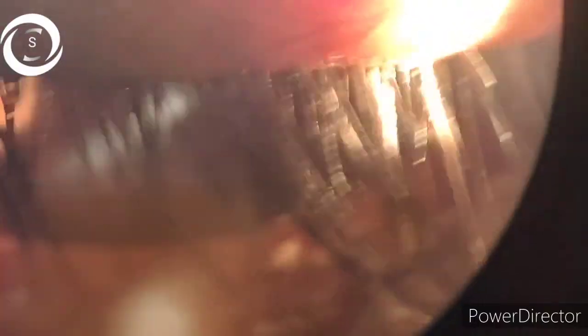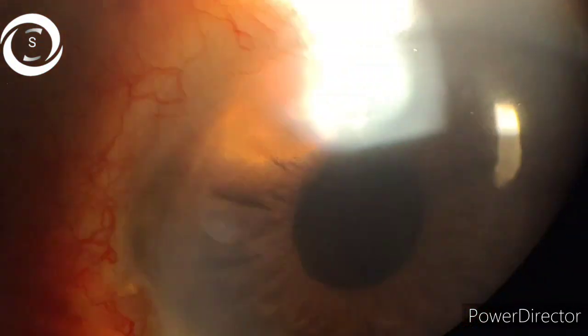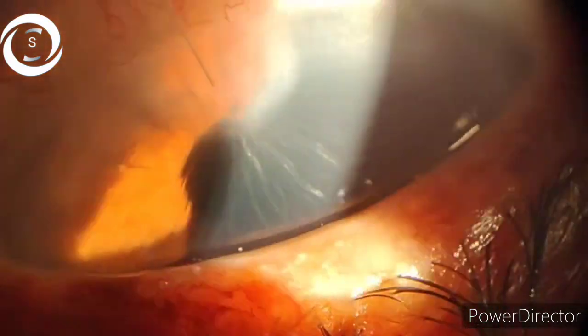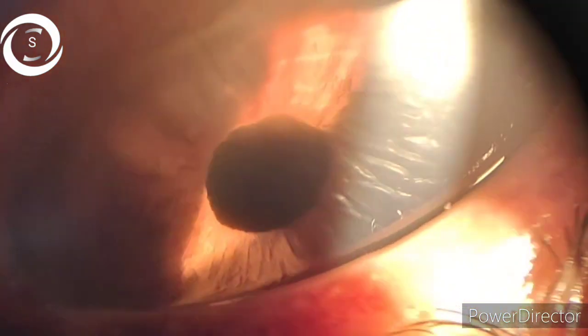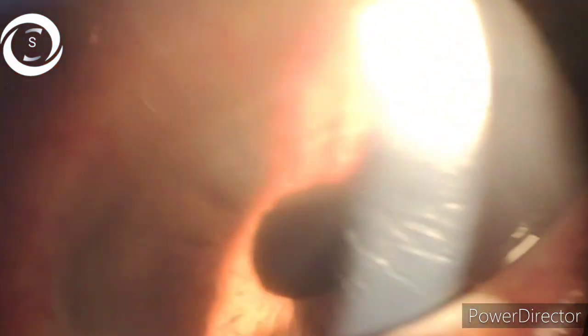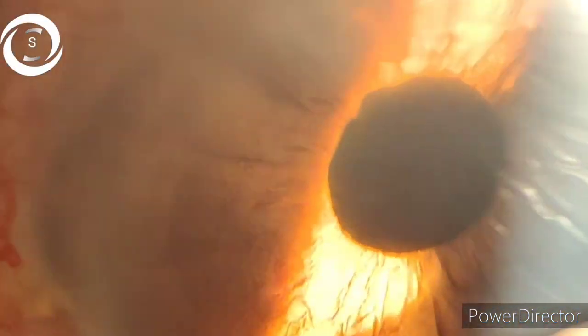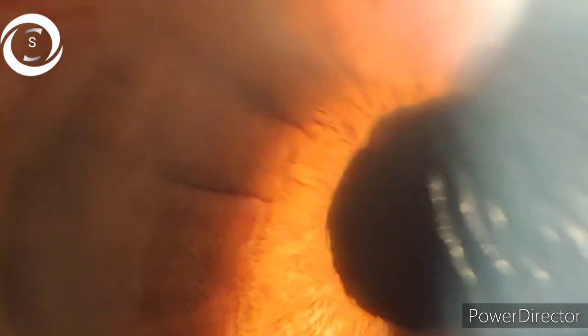The first patient is post-phaco with foldable IOL, with one tight suture causing wound compression. Look at the vertical lines in the cornea radiating from the suture and spreading radially in all directions. You can clearly see these lines in the cornea, just like Descemet's folds. Patients are usually asymptomatic except for a decrease of vision following tight suturing.